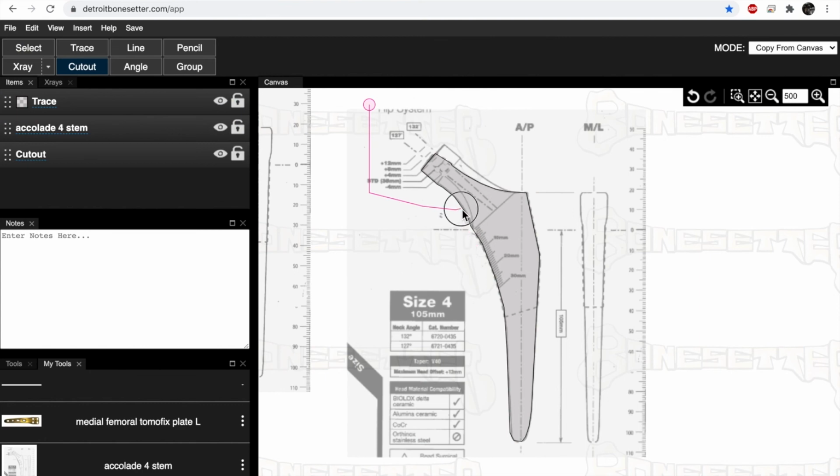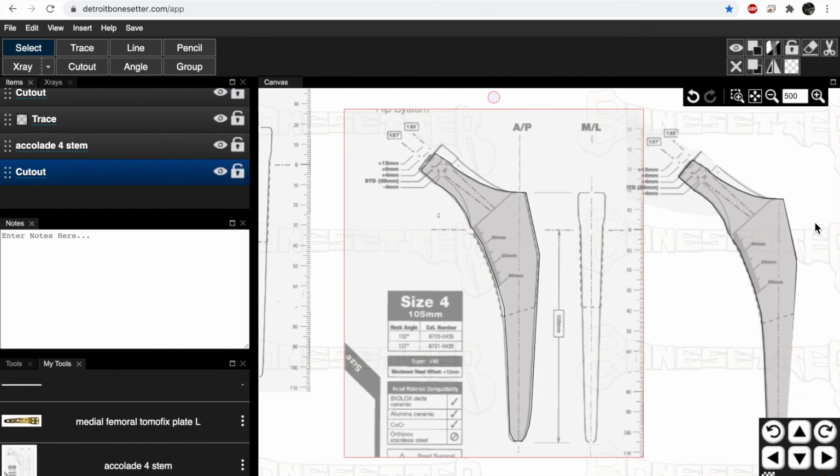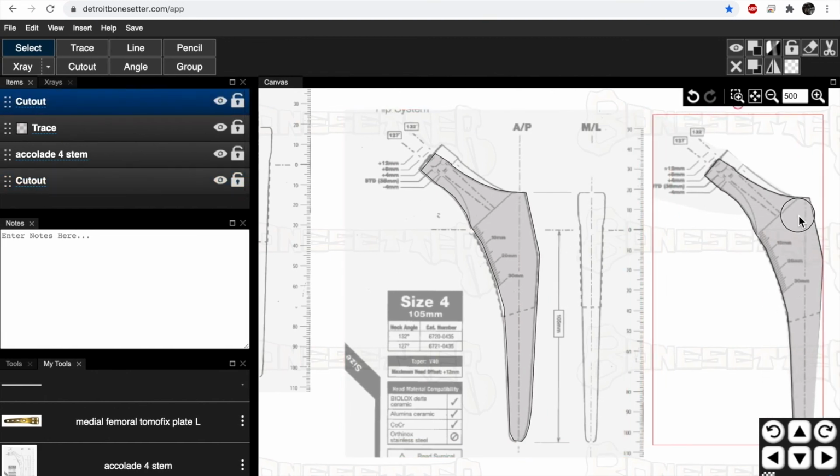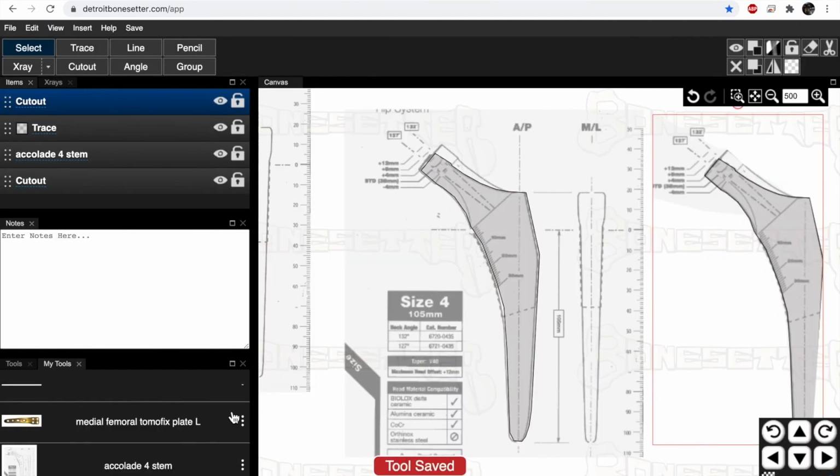I could bring it over like this, and now my tool is just these pieces here, and I can add to my toolbox, edit, add item to toolbox, and again I can put Accolade 4 stem, and add, and tool saved.